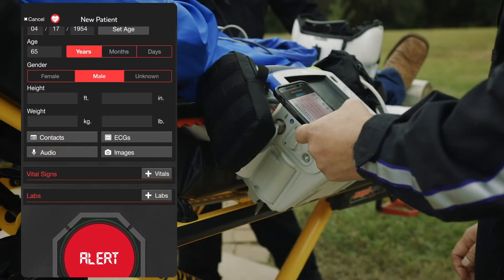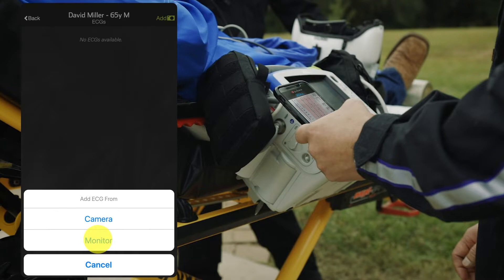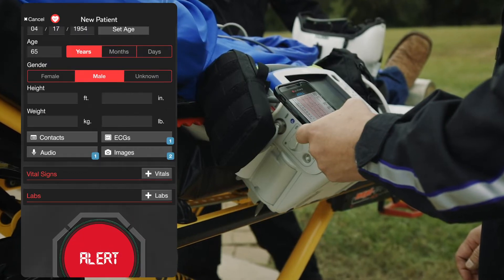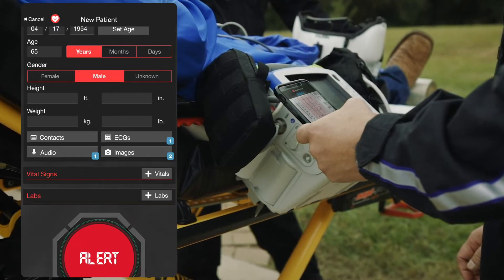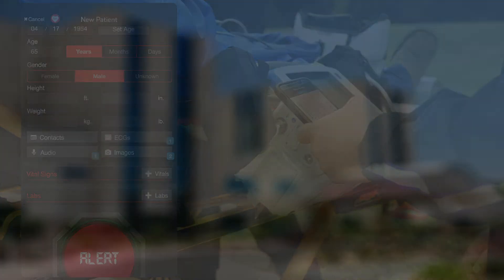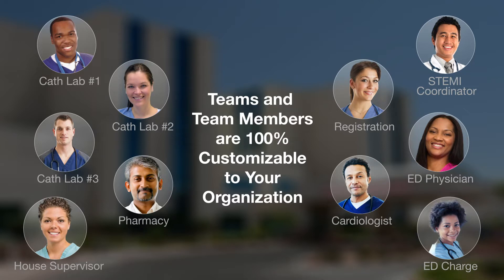The medic may also take advantage of one of our integrations to pull the ECG from the cloud, as demonstrated here. The key difference between a traditional radio report and a Pulsara report is all downstream team members now have access to the critical information. This can even replace the short form in many locations.